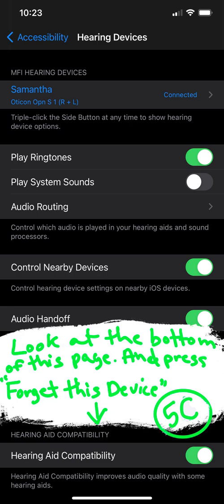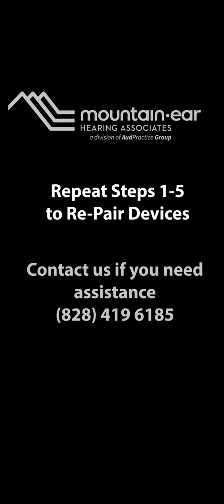Under five C, look at the bottom where it says your name and your brand of hearing aids. If you need to unpair your hearing aids, you will 'Forget This Device' and then go back and restart steps one through five to re-pair the devices. This process can also be used for pairing your iPad to your hearing aids. Thank you.